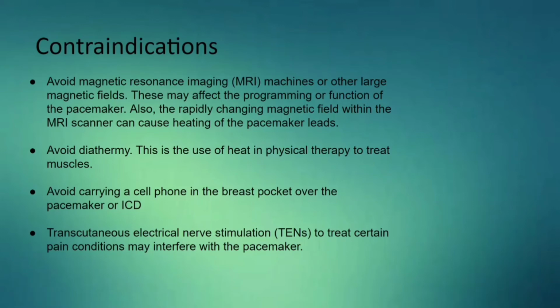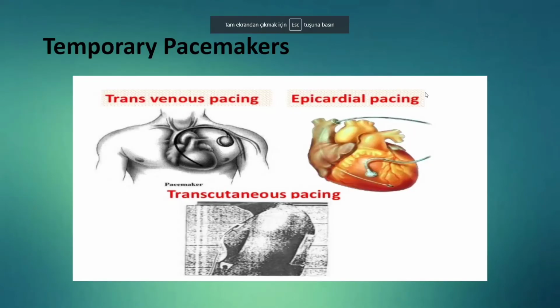And now Mehmet will continue with the temporary pacemaker. Hi, I'll explain temporary pacemakers and then future studies of pacemakers. So let's continue with how we are going to temporarily pace patients. We can do transcutaneous, transvenous, which is also referred to as endocardial, and finally epicardial pacing.